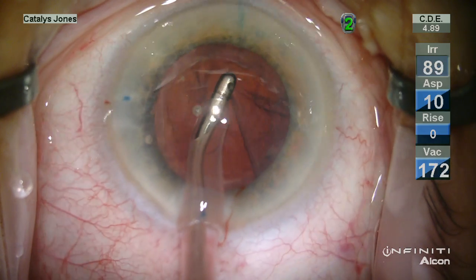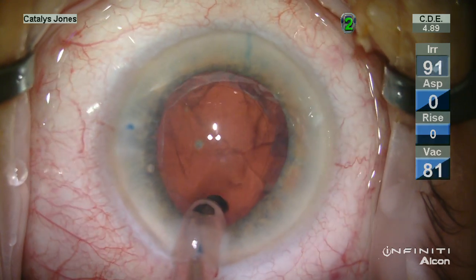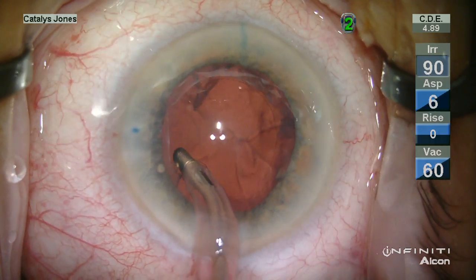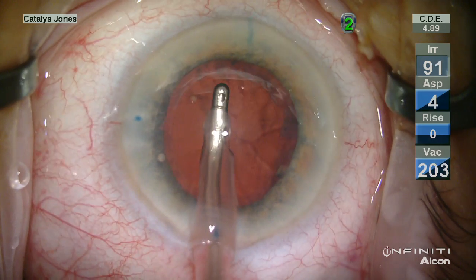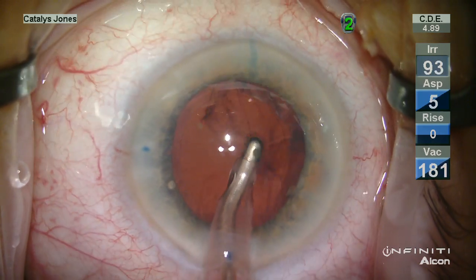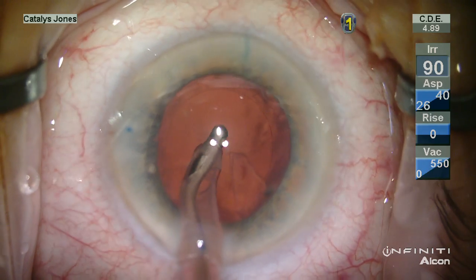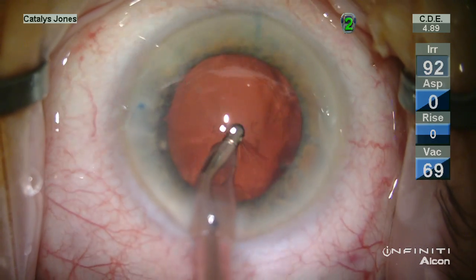Coaxial irrigation-aspiration is my preferred method of cortical removal. I find that the laser treatment provides minimal hindrance to evacuating and mobilizing the cortical elements from the capsular bag. It's also important to note the stability of the capsular bag, as in any case with pseudoexfoliation we are always attuned to issues that may indicate zonular laxity. We also want to evacuate completely all cortical remnants to prevent asymmetric capsular fibrosis, which may predispose to anterior capsulotomy phimosis.